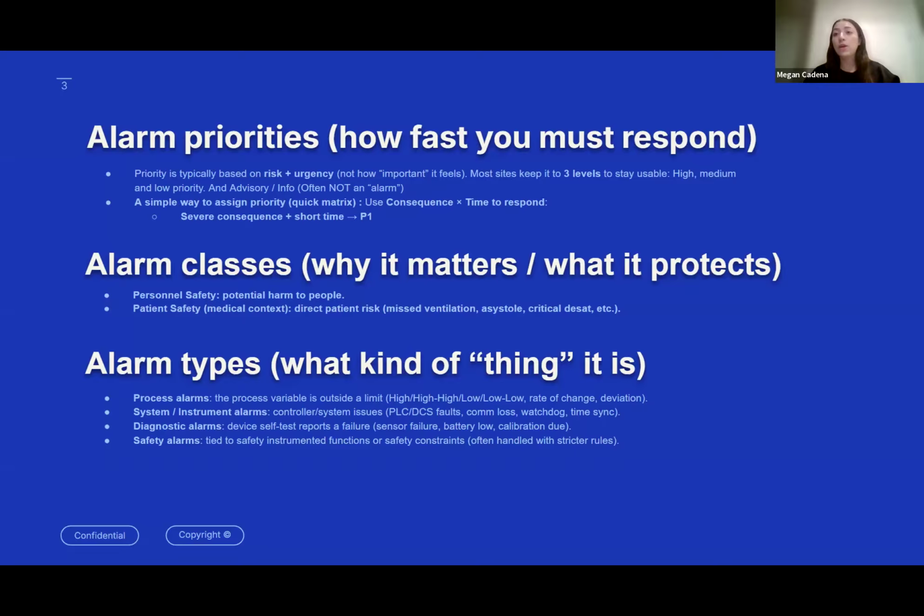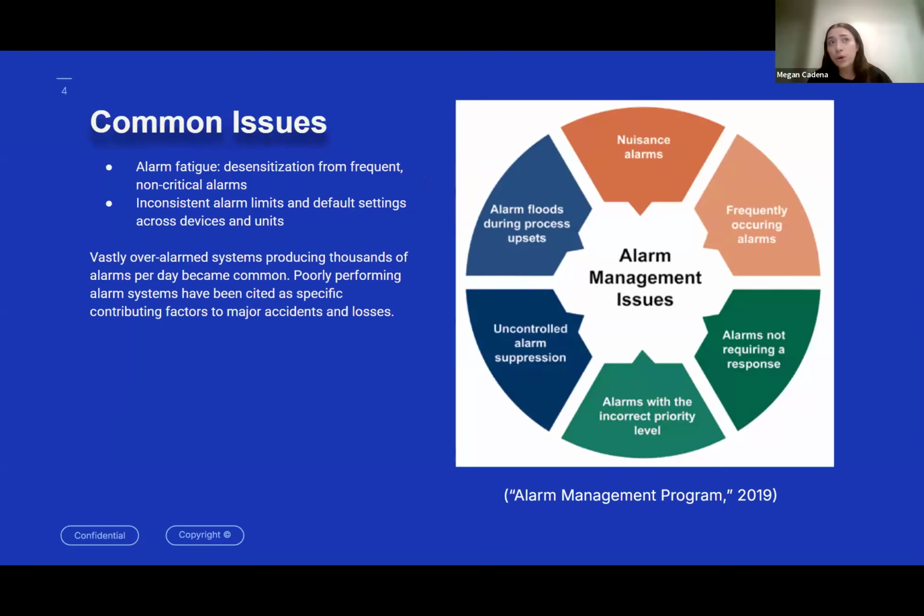If you have a very major consequence to the patient, then you're typically going to have a shorter time to act. Whereas when it's less severe of a consequence, you typically have a longer period of duration to respond or mitigate the alarm. And of course, there are permutations that fall somewhere in between those two boundary cases. This is important because this tells you how to classify different alarms into different classes, and even within those classes, how you prioritize risk or the priority of things in your specific design system.